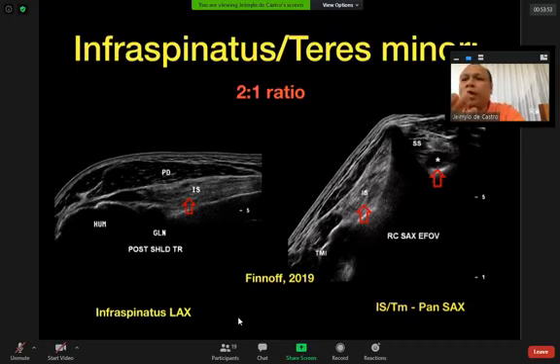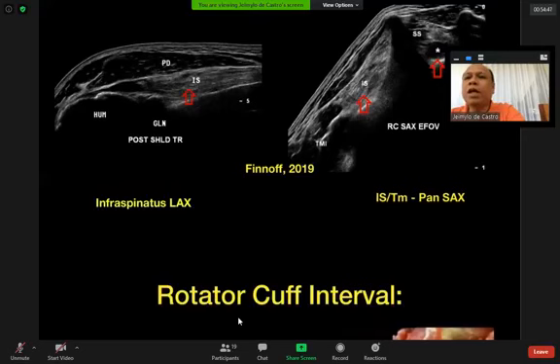You can see that the size of the infraspinatus is really large, twice as large as the teres minor. Now you try to see this in the short axis from the spine of the scapula. You scan the muscle down, and the first muscle that you can see is your infraspinatus. Then as you go towards the lateral side, as you rotate your probe obliquely, you can also see the teres minor. In between the teres minor and the infraspinatus, there is a hump. That hump indicates that you are already passing beyond the infraspinatus, and the next muscle after that would be your teres minor. This is very important in order to see if the muscle can actually hold the joint if there is a surgery being done in the supraspinatus.